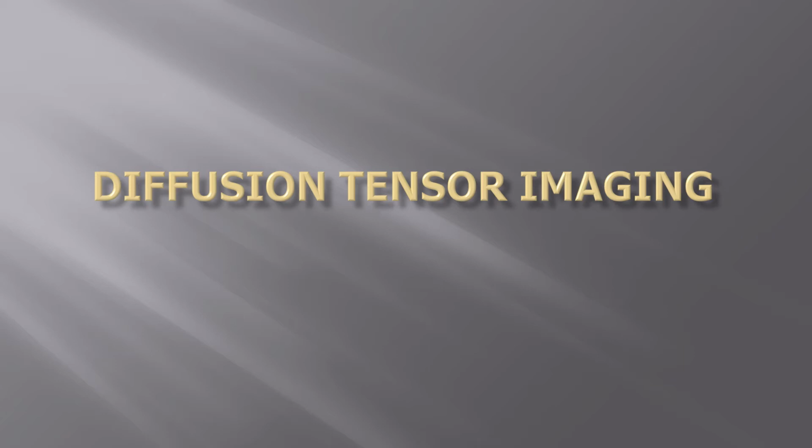Okay, diffusion tensor imaging. Basically, it's DWI with a lot more directions, anywhere from 6 directions to maybe 128 directions or even more. Basically, you get these more diffusion directions in hope of better delineating the directionality and characteristics of the white matter tracts. That's typically the reason.